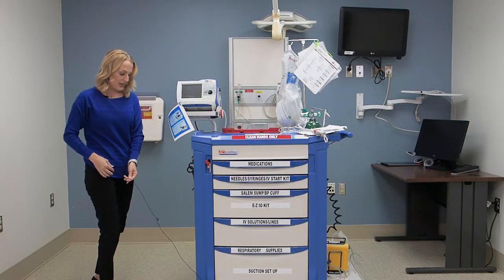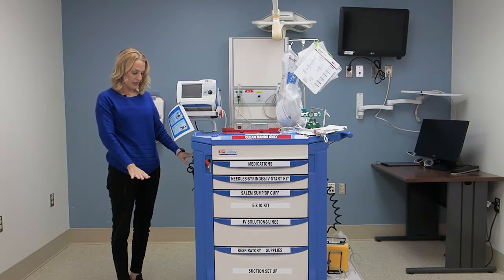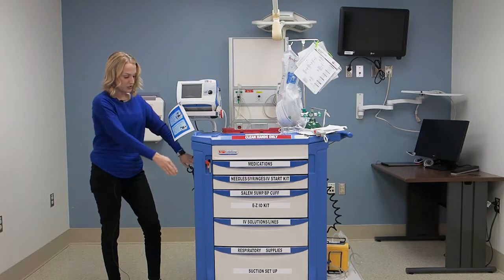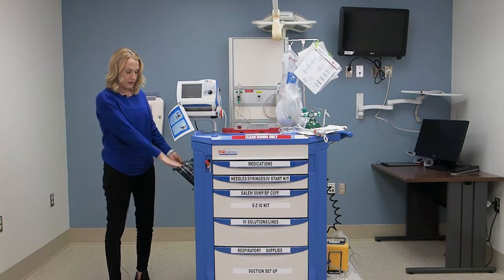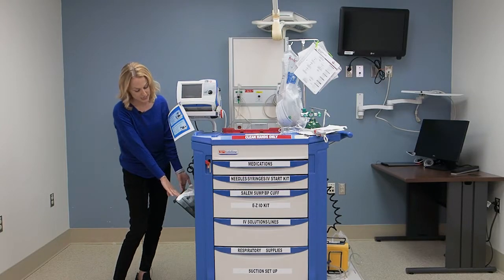On the side of our cart, on the right side, you're going to find supplies that you would need for intubation. We have two bins. They simply open, and in the top bin you have things for the glide scope and the LMA. And in the second bin is where you're going to find the stylet and different sizes of ET tubes.